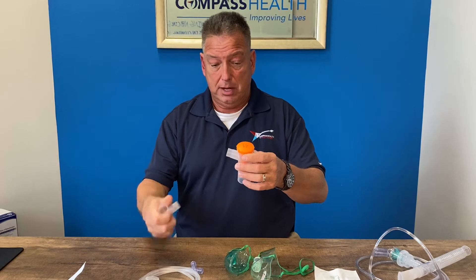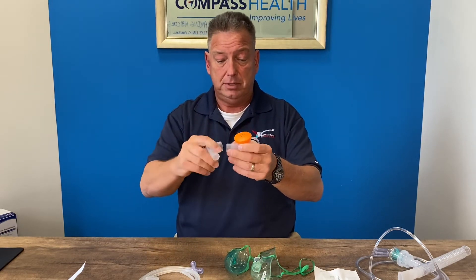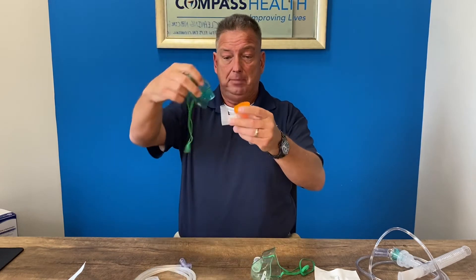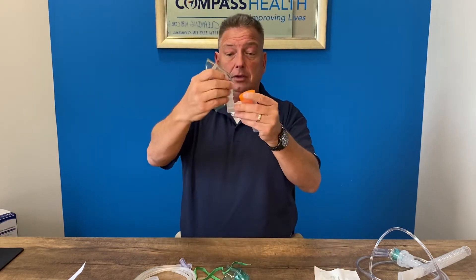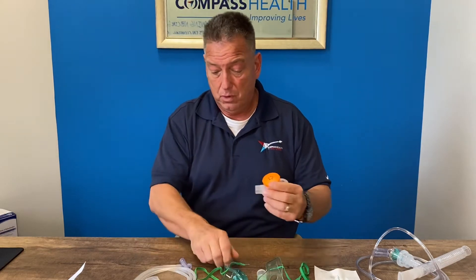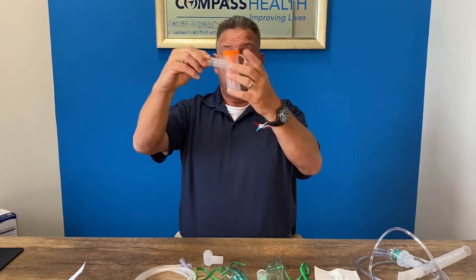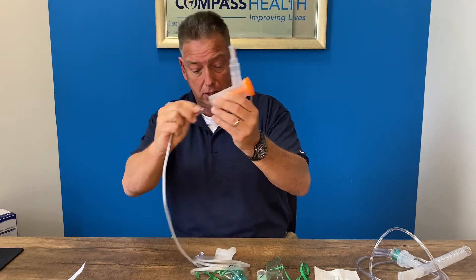This product has an elbow piece that goes on to accept either a pediatric mask or adult mask depending on the application, or the mouthpiece will go directly onto the cup. And once again, tubing is installed on the bottom.